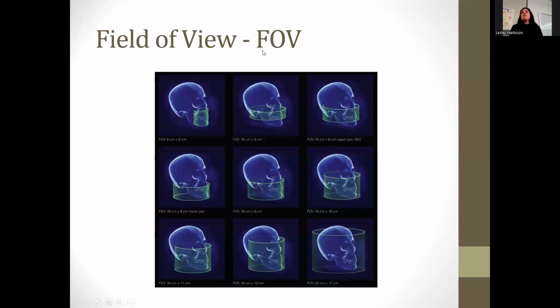There's something called the field of view, which is probably a term that you'll be tested on. There's not a lot. I'm not going to pull into detail a lot of stuff on quizzes and tests for this section. This falls very largely in a nice to know category, not a have to know. I want you to know what are some things that you might use this for. This term field of view is important for you to know. And what you can see about it is that you can change the field of view.